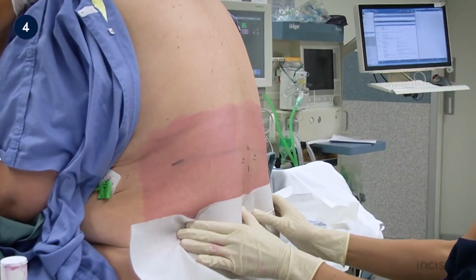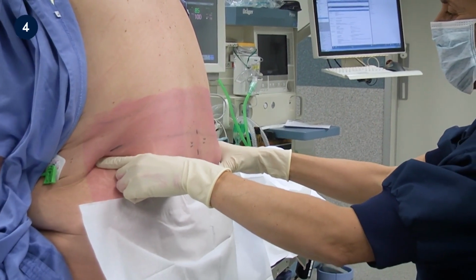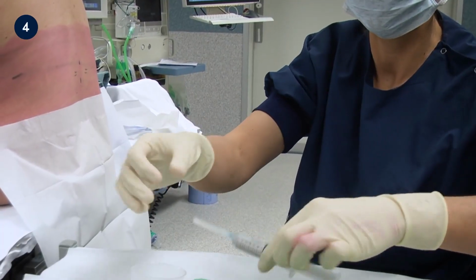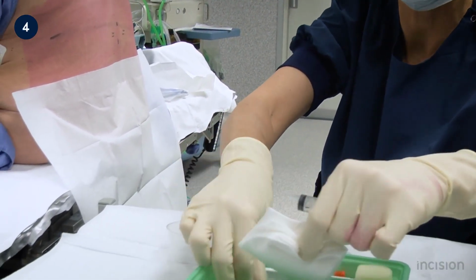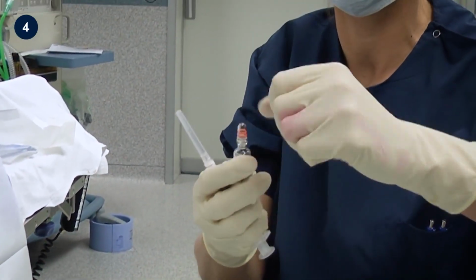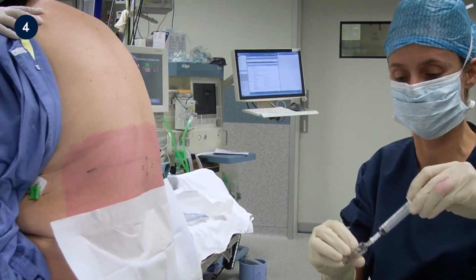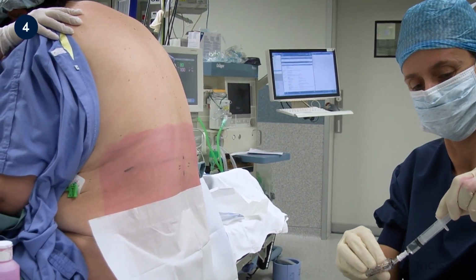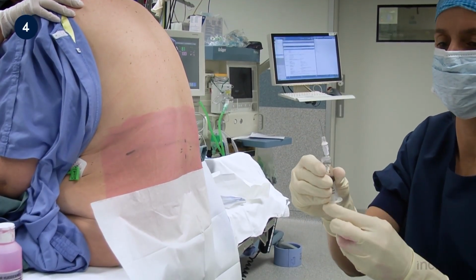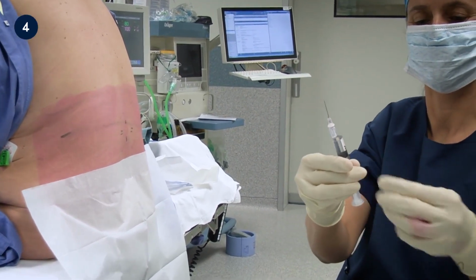If required, the anaesthetist may once again palpate the level of the iliac crests in order to confirm the L4-L5 space. With this done, the anaesthetist turns to the sterile tray or spinal pack and draws up the medication. Firstly, lignocaine in a 10 ml syringe and then bupivacaine. As always, it is important to check the contents and concentration of the ampule before administering any medication to a patient. The anaesthetist will now do so with the anaesthetic nurse, who in this film is off-screen. The confirmatory check is made visually and verbally.